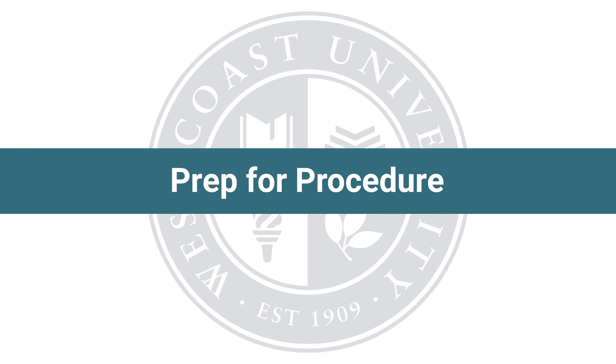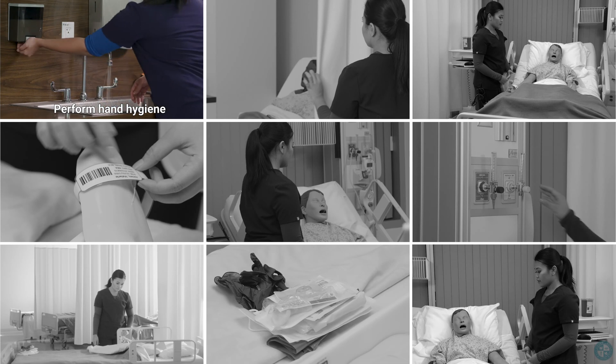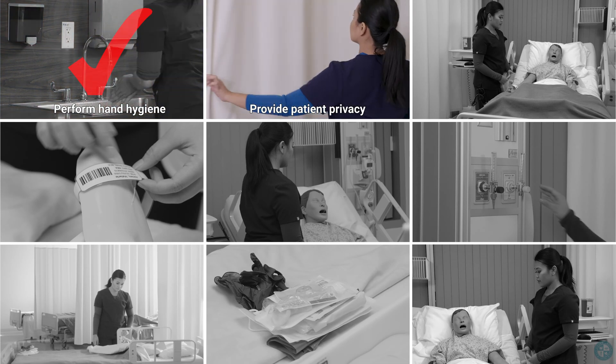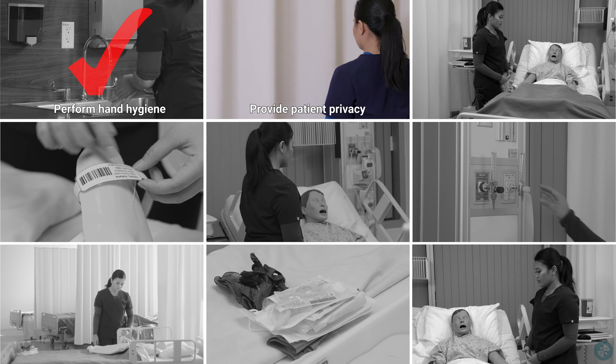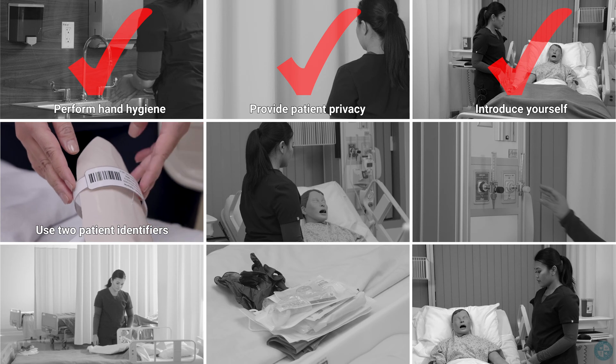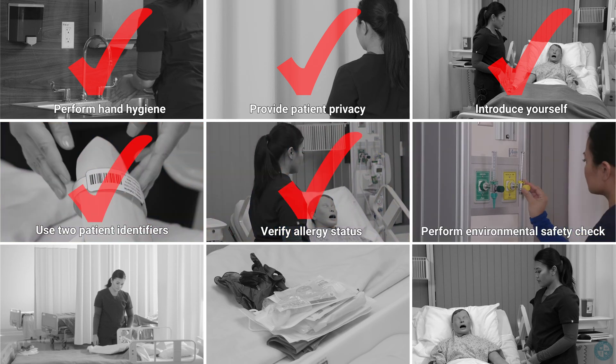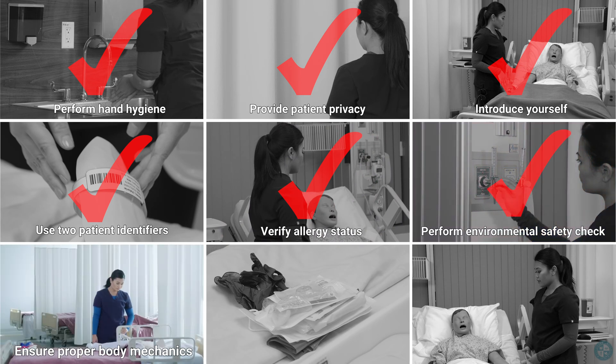Before beginning this procedure, always perform the following steps to ensure patient safety. Perform hand hygiene. Provide patient privacy. Introduce yourself. Use two patient identifiers. Verify allergy status. Perform environmental safety check.